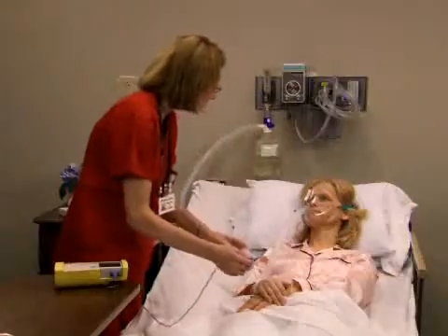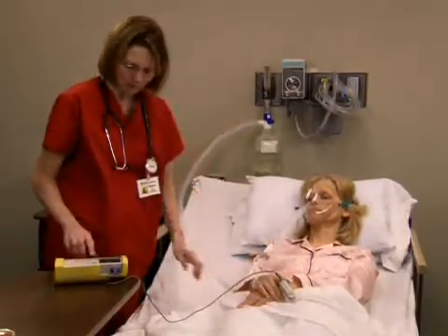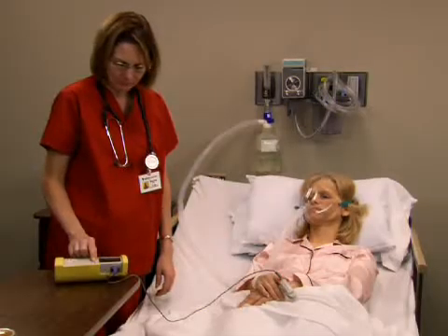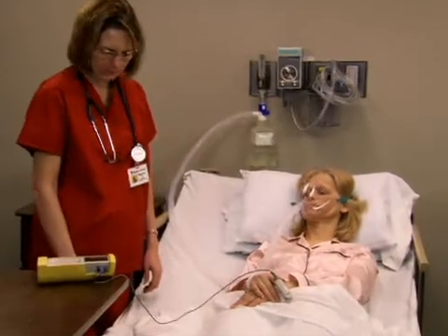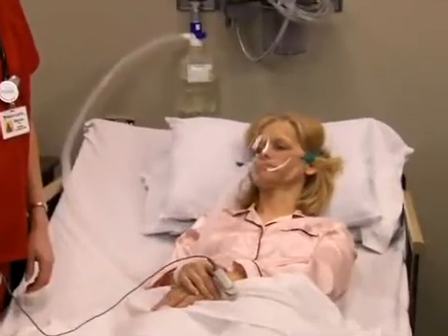Ms. Walters, I'm going to check your oximetry. Just relax your hand. As part of your follow-up care, monitor the patient's pulse oximetry and ABG levels. If they're not in the expected range, notify the physician, who may order a flow rate adjustment.